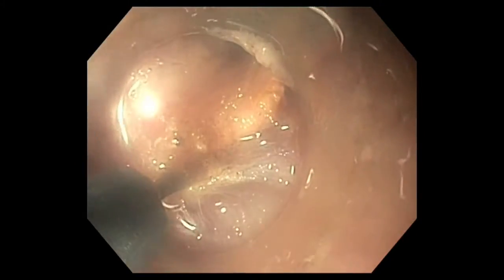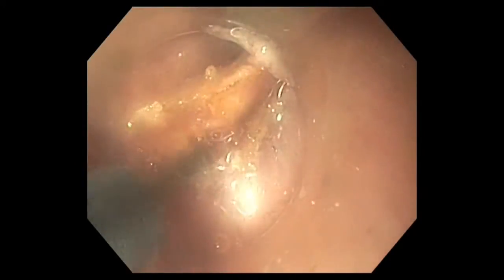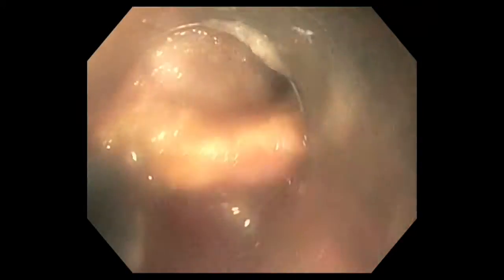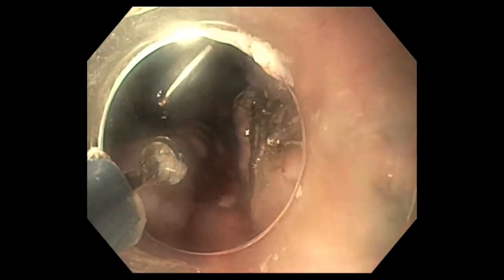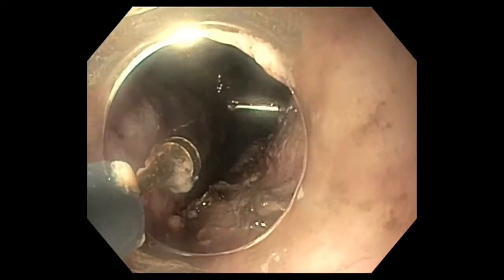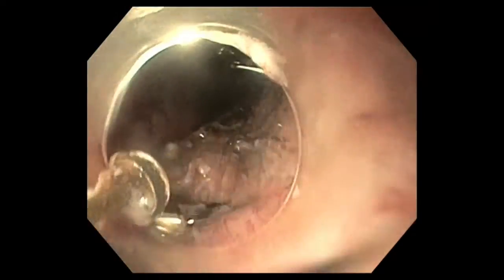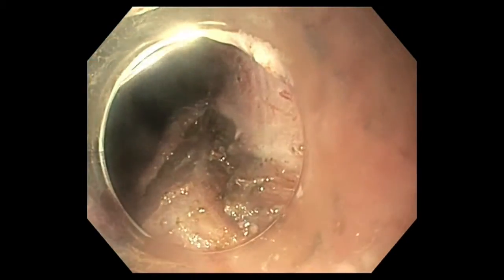At the end of the procedure, we inspected the artificial ulcer for wall defects and vessels. All visible vessels were coagulated and multiple clips were placed to close the artificial ulcer.